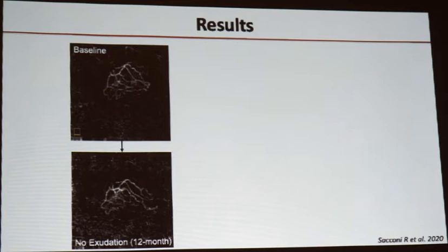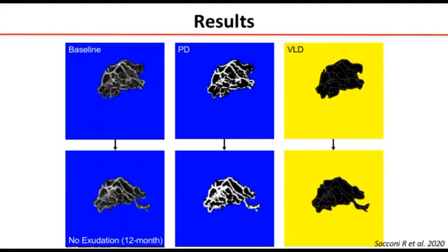results. We have identified 2 different groups of patients. In the first group of patients, there was a macular neovascularization with no exudation, or exudation after more than 6 months. And this kind of patient was characterized by a macular neovascularization with, you can see here, large vessels, a low rate of capillaries, and also after binarization and skeletonization, you can see that the number of capillaries was very low. There are only great vessels.